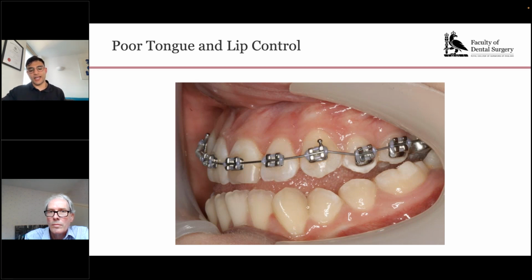And if you're really picky about having all the information from your photographs, then you can change the settings on your camera so you get a RAW file as well as a JPEG every time you take a photograph. And because you've got a RAW file, if the photo's not turned out absolutely brilliantly in terms of exposure, you've got more capacity to change that in post-production and make it brighter, and account for some of the issues that you would have with not having the exposure right in the first place. But if you get it right the first time, then you don't need to bother doing that. But a RAW file gives you that lateral ability, that sort of option.